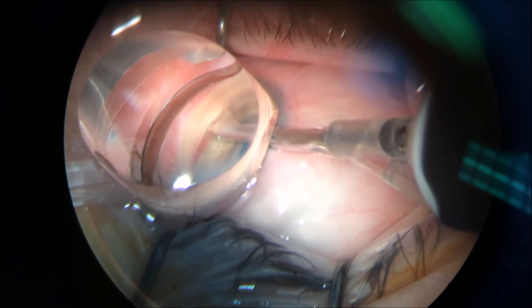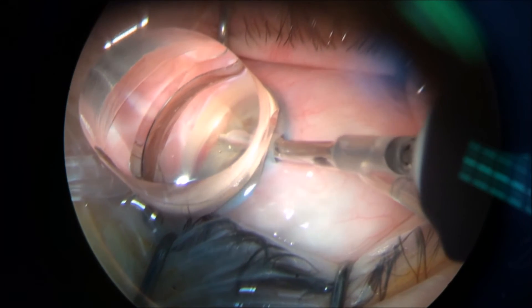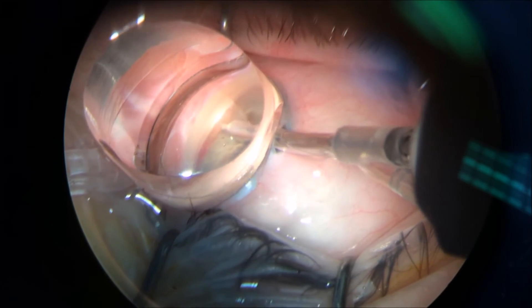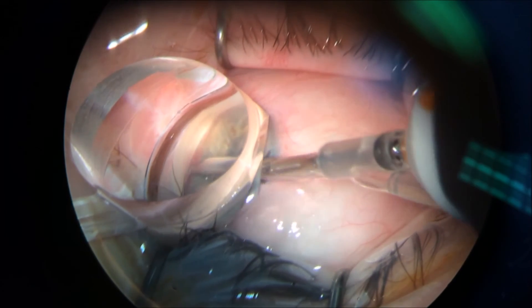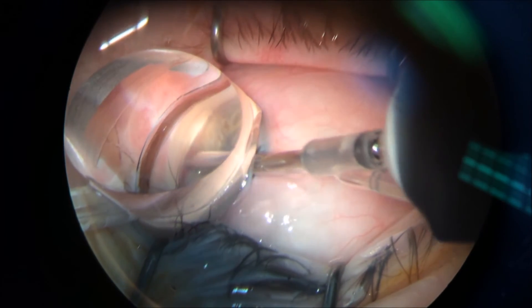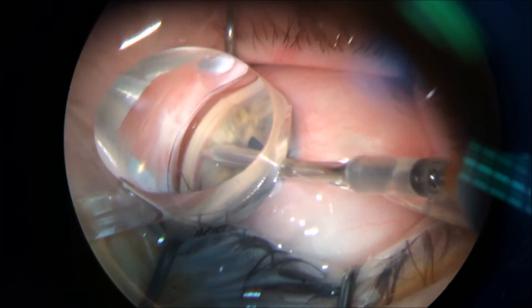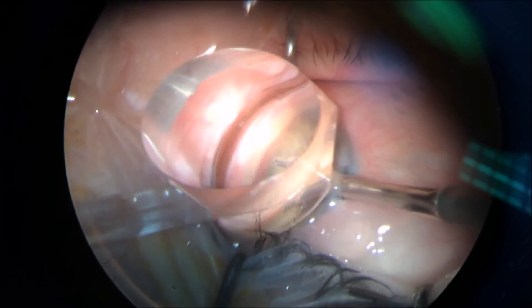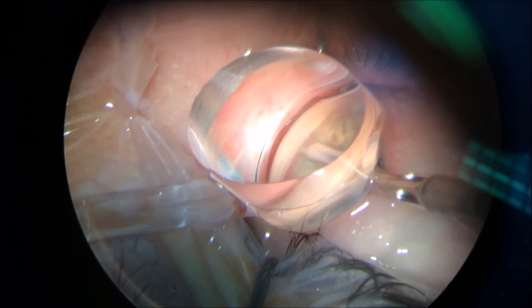It's a very safe procedure. It is done by one 2.2 corneal incision under the gonioscopic view. Once you get used to the gonioscopic lens, working under it is a very easy and quick technique to proceed and do.